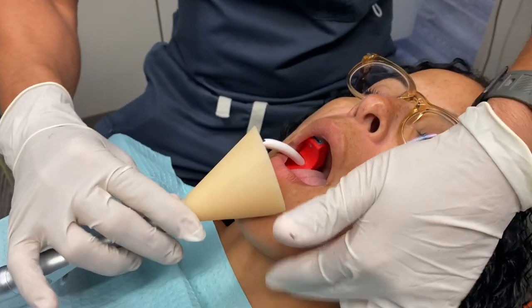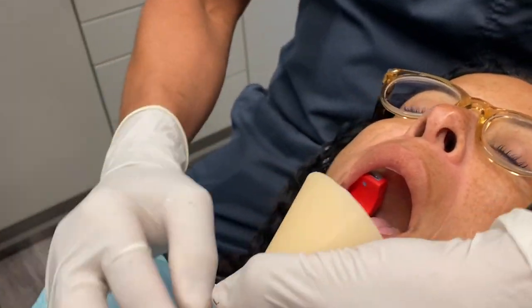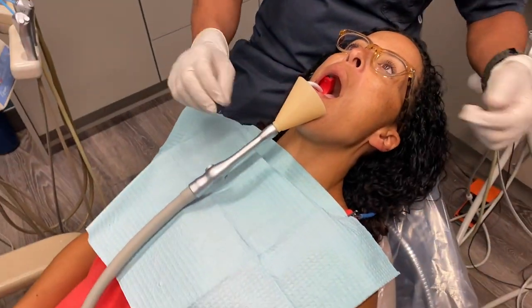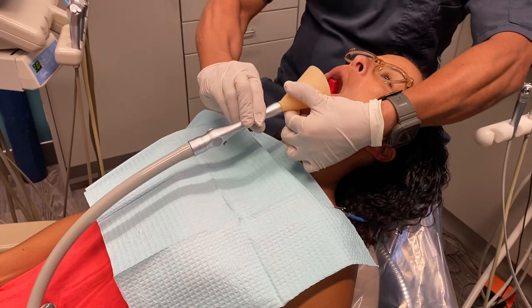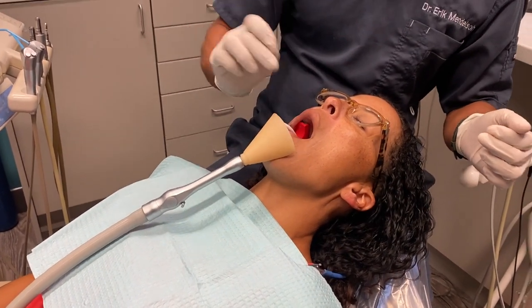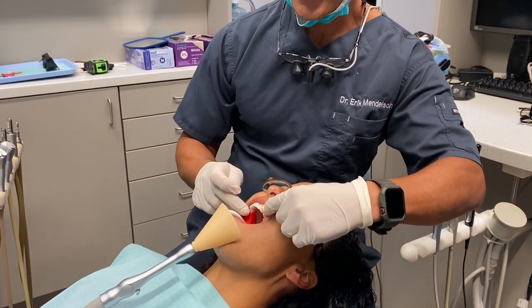Lift your chin just a hair and you can see it sits right on the chin. And if we need to adjust the angle you can spin there, spin tighter to get a nice tight seal right under the lip, and that's going to give us pretty good clearance to do whatever dentistry we need to.